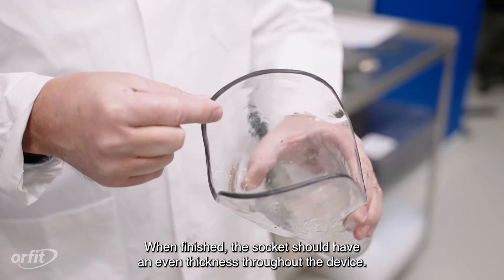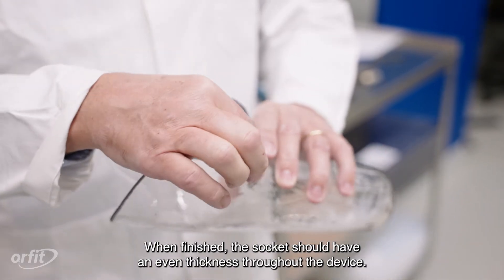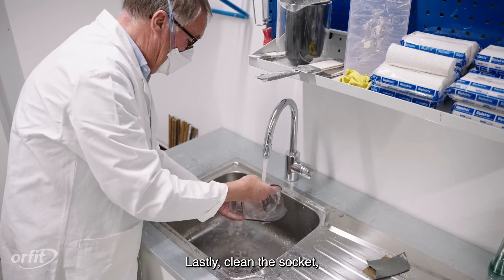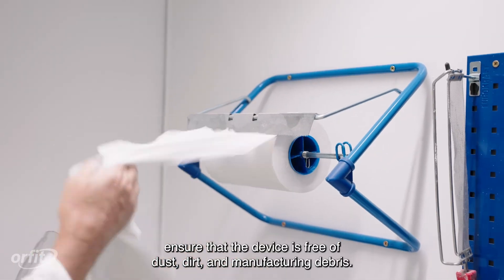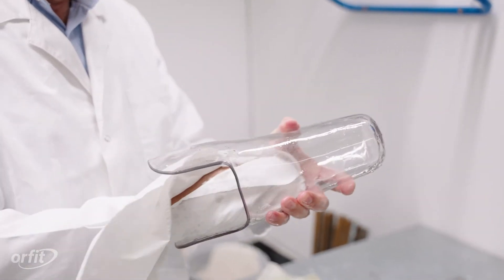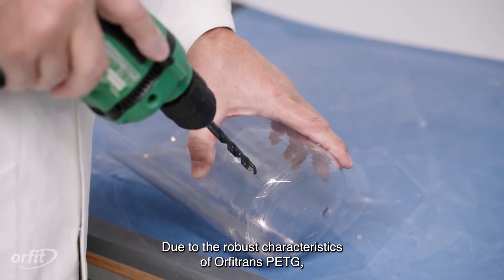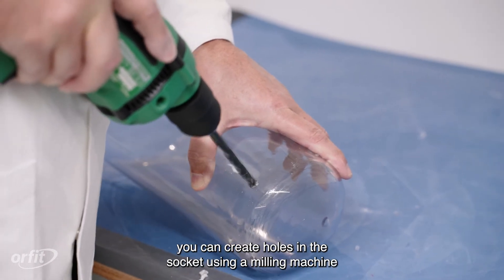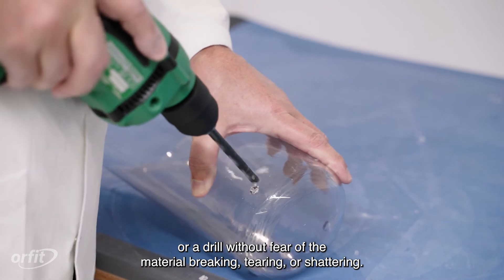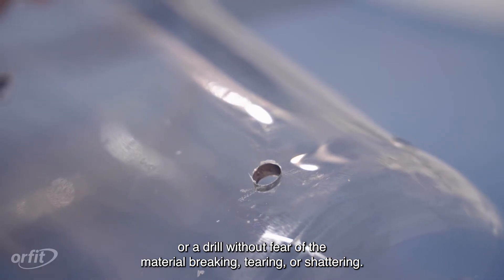When finished, the socket should have an even thickness throughout the device. Lastly, clean the socket and ensure that the device is free of dust, dirt, and manufacturing debris. Due to the robust characteristics of Orfitrans PETG, you can create holes in the socket using a milling machine or a drill without fear of the material breaking, tearing, or shattering.